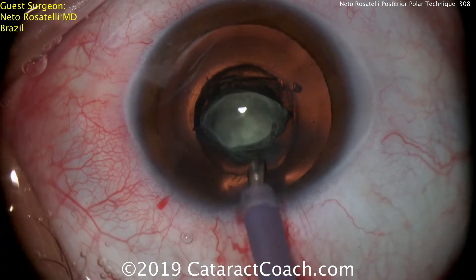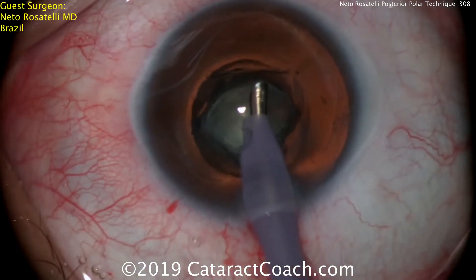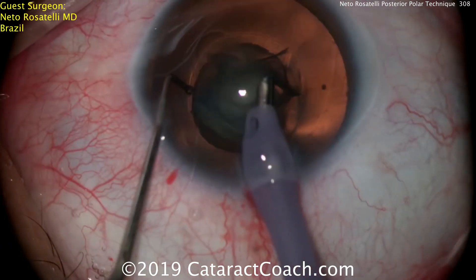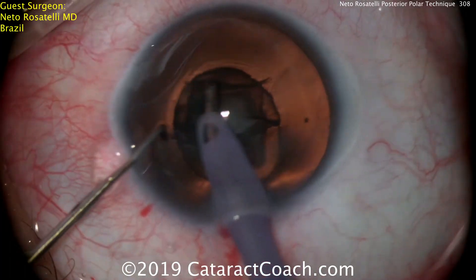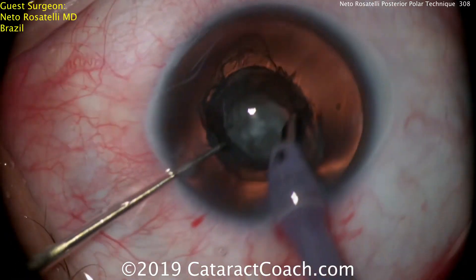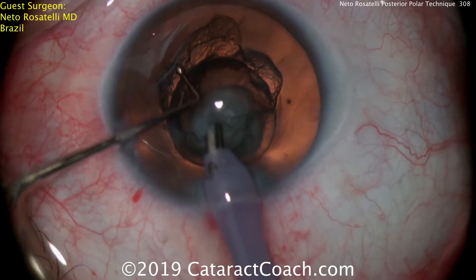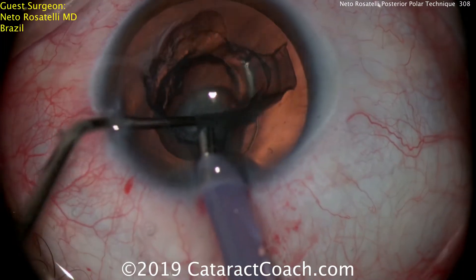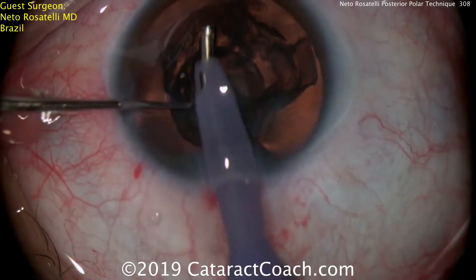Now he's going to use the phaco probe to aspirate that endonucleus, with the chopper in the other hand. What I find so amazing about this technique is what happens after he moves this central endonucleus — you'll see how he uses the chopper. I've never seen this before. He uses the chopper to help dissect out the rest of the cataract — the rest of the nucleus, the epinuclear shell. He'll place the chopper and go around to dissect up the rest of the epinuclear shell.